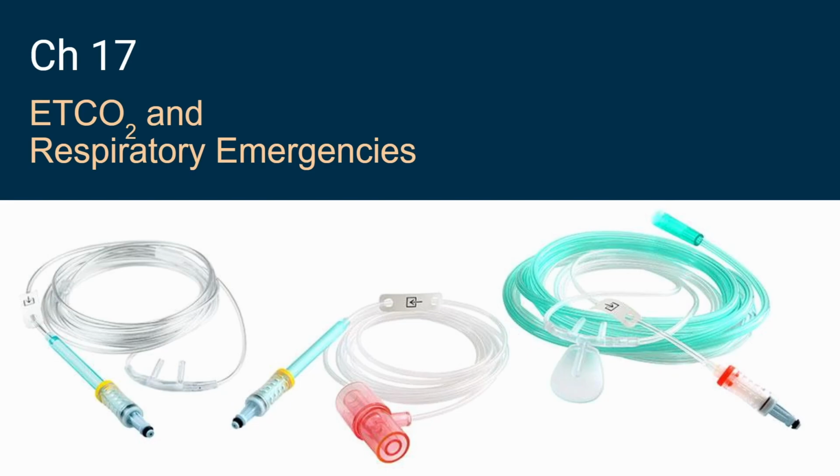In any event, we can put end tidal on in a myriad of ways, and we should do that each time. This is of course an orange or pink or coral, I don't know. Essentially it is our inline to be done between our advanced airways and our BVM. And then of course we've got other ones like our nasal capnography with either the fin to catch it or not. Now, you would not believe the amount of times I see some poor paramedic who can't get a good capnography, not really sure about what's going on, and all I did was go over there and push that little paddle down a little bit, and then suddenly the end tidal looks great.